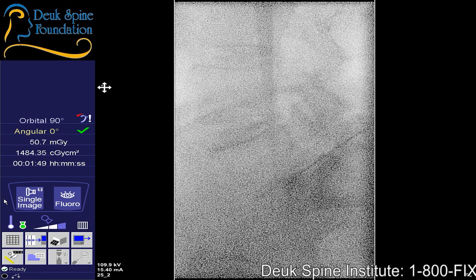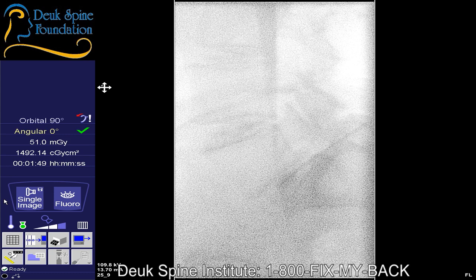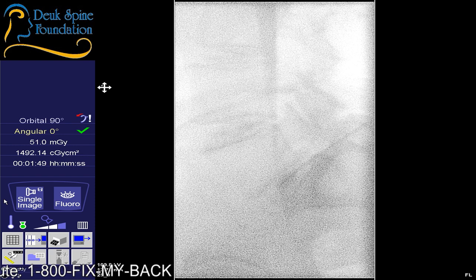So you're watching a surgery that's live, unedited, and we don't edit our surgeries. We basically show you everything. So you're going to encounter the same problems that we encounter during the surgery. You're going to get to see how we deal with it, and everything is done in real time. That's not good enough for me. So drop the table a little bit, maybe bring the collimator in, but you got to figure out a way to get me a better picture.